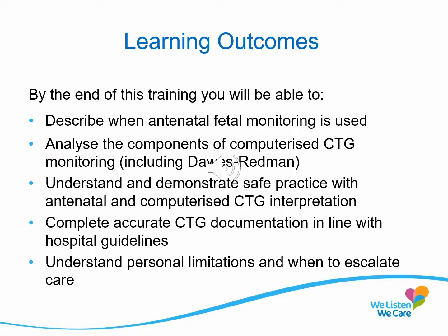The learning outcome of this module is to be able to describe when antenatal fetal monitoring is used, to analyze the components of computerized CTG monitoring, including Dawes-Redman criteria, to understand and demonstrate safe practice with antenatal and computerized CTG interpretation, to complete accurate CTG documentation in line with hospital guidelines, and to understand personal limitations and when to escalate care.